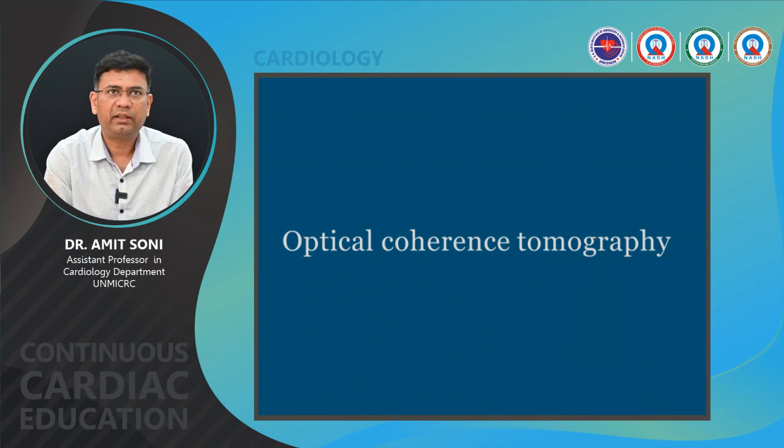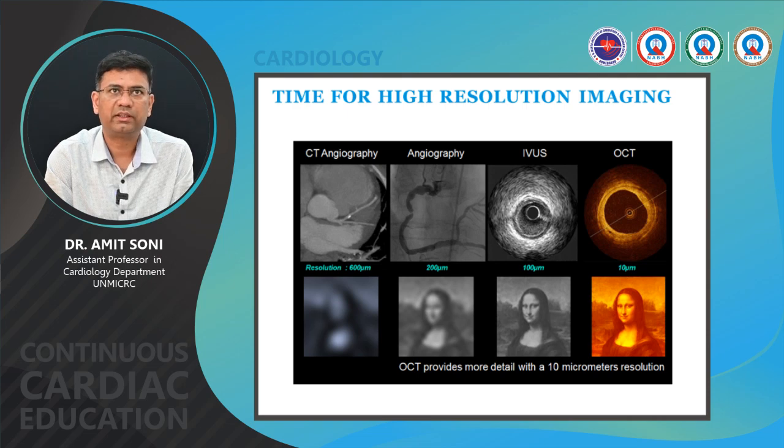Good evening everyone. Today we will discuss optical coherence tomography. So this is the time for high resolution imaging. We can see in this picture that one picture shows a CT angiographic view, another an angiographic view, and the third one is IVUS and then OCT.